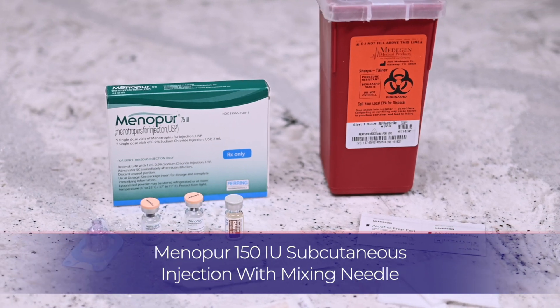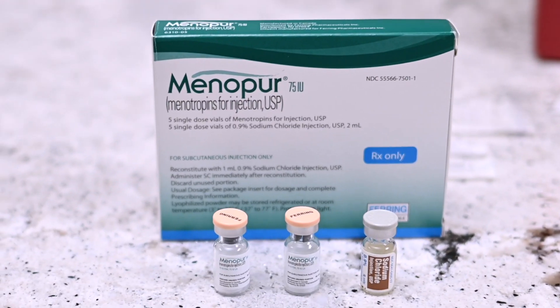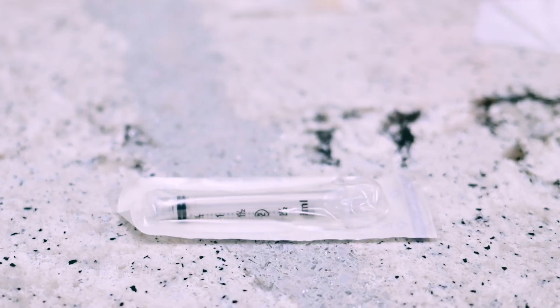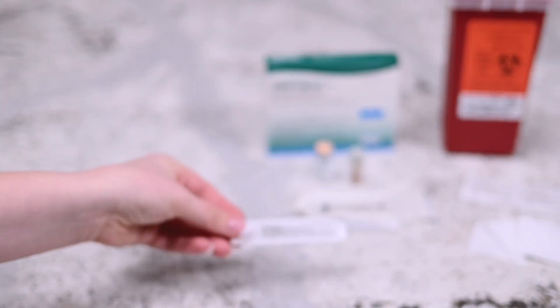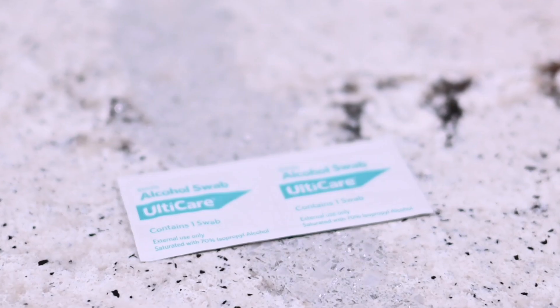You will need the following: two vials of Menopur powder, one vial of sterile diluent, syringe with 22 gauge one and a half inch mixing needle, 27 gauge half inch needle, alcohol prep wipes, gauze, and a sharps container.